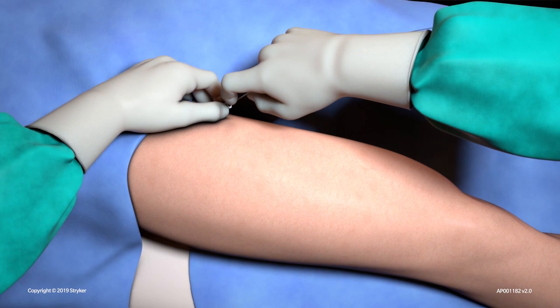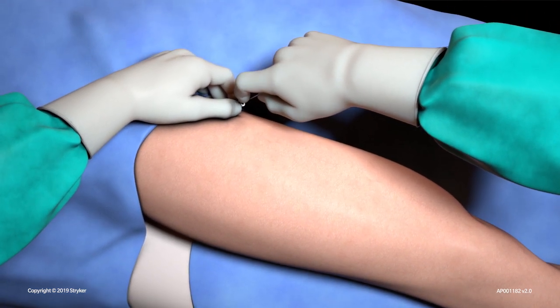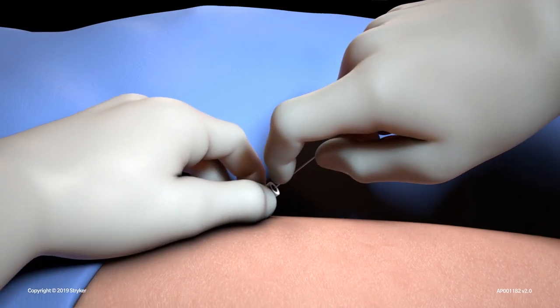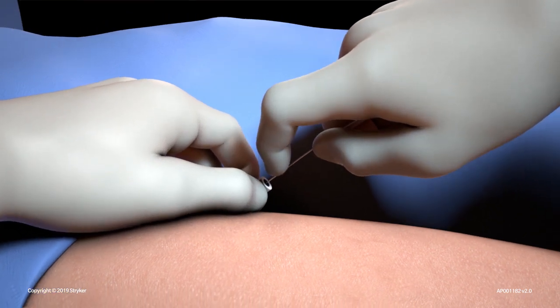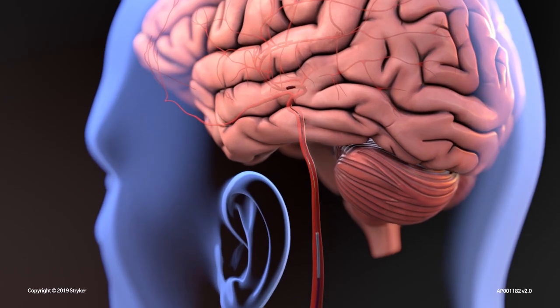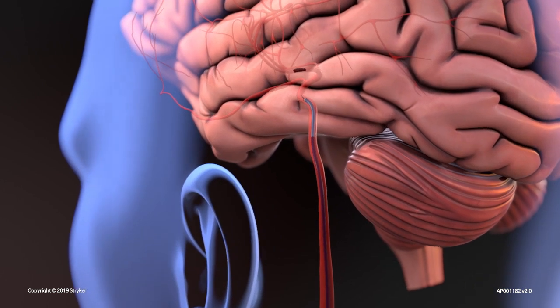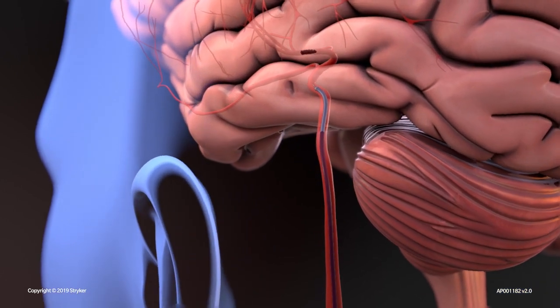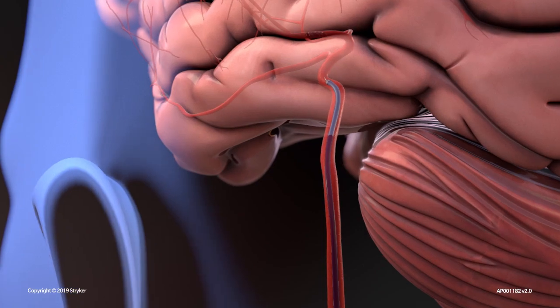The minimally invasive clot retrieval procedure begins by gaining access to the large artery in the groin, called the femoral artery. From the groin, the physician navigates a balloon guide catheter into an artery in the brain called the internal carotid artery.